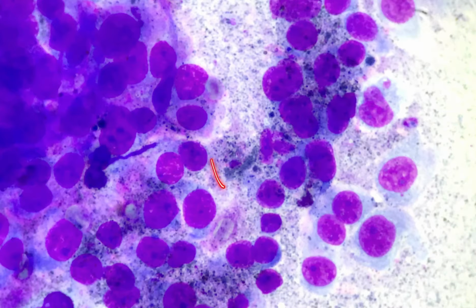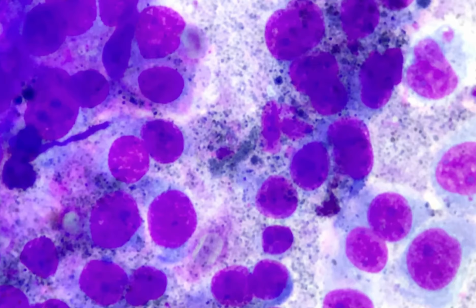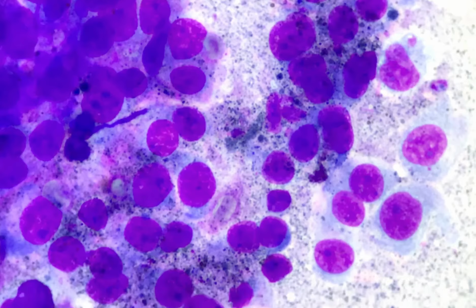abundant melanin granules. They are green black in color. So this is highly suggestive of malignant melanoma.